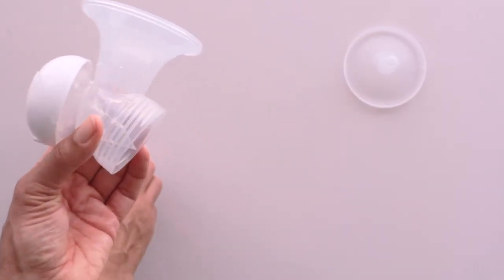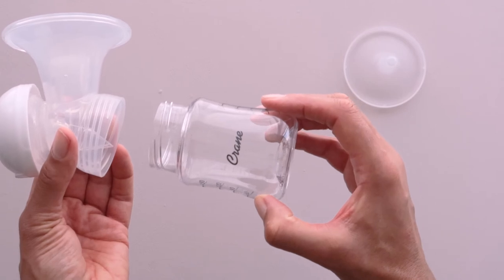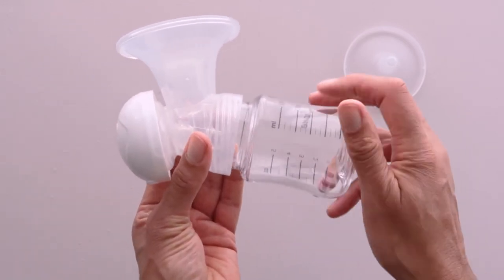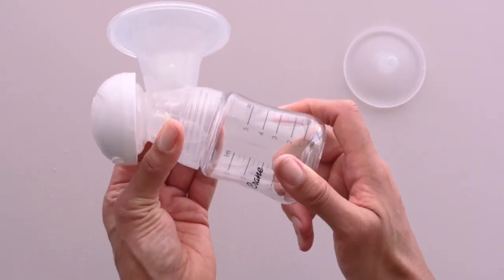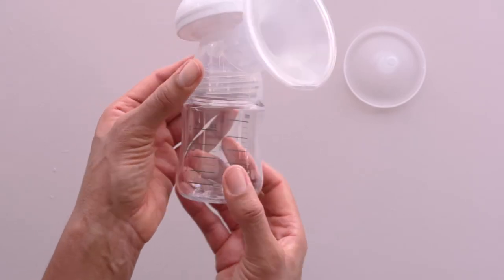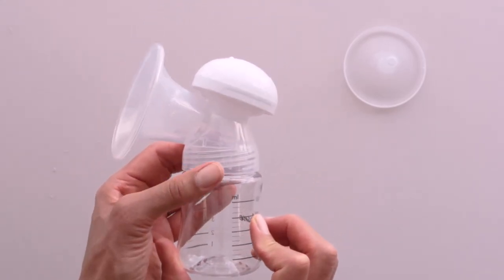Attaching the bottle. Carefully screw on the bottle into the base of the breast shield body. The bottles are made of Triton BPA-free plastic.